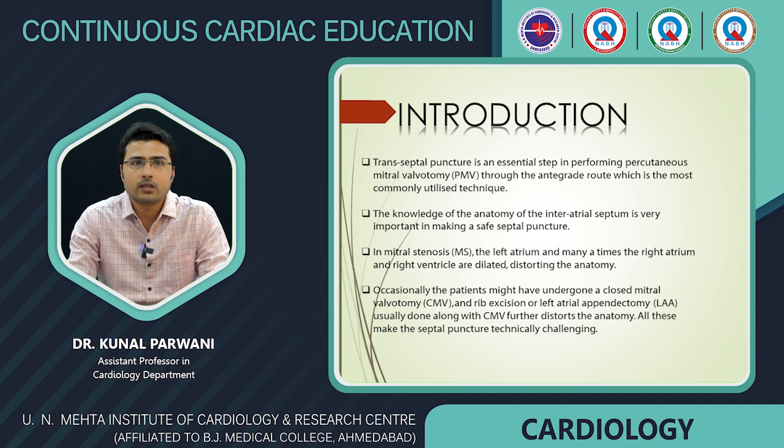In mitral stenosis, the left atrium and many a times the right atrium are hugely dilated, distorting the anatomy. And occasionally the patient might have undergone closed mitral valvotomy and LA appendage excision, further distorting the anatomy, and these all can bring about challenges in performing a safe transseptal puncture.